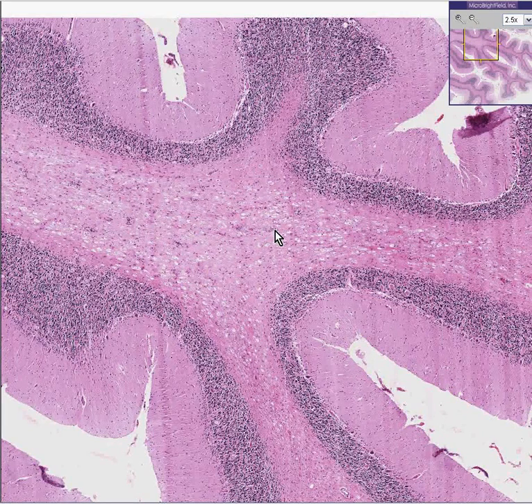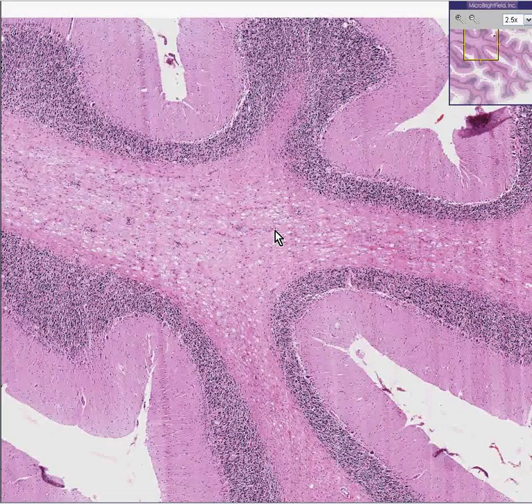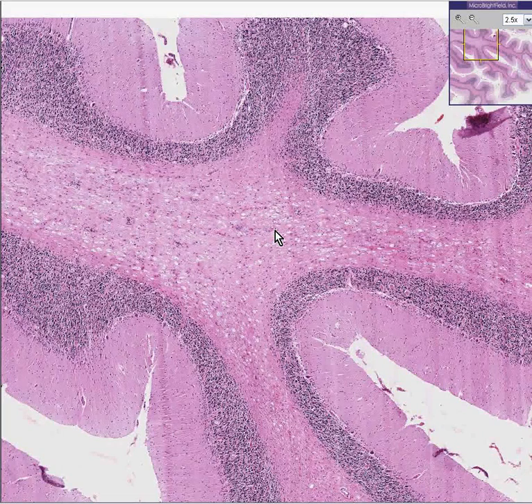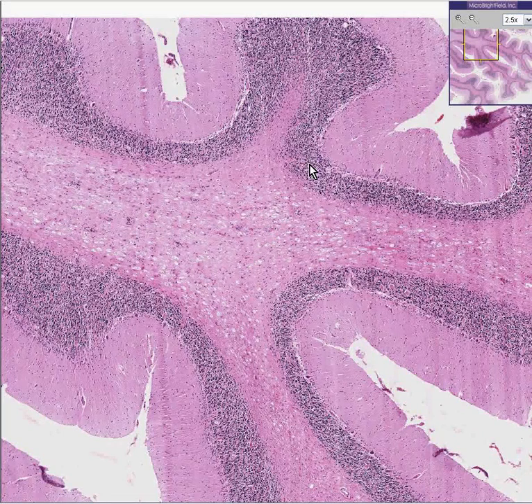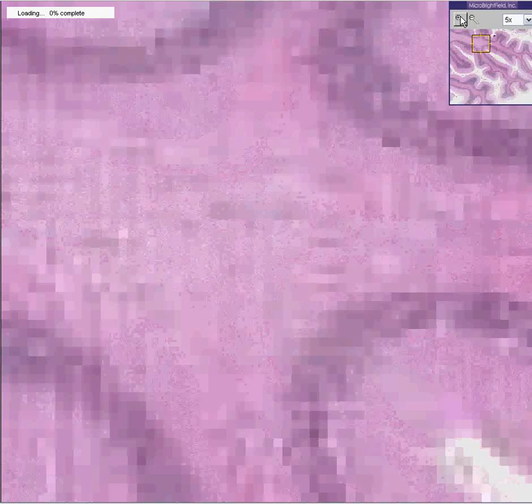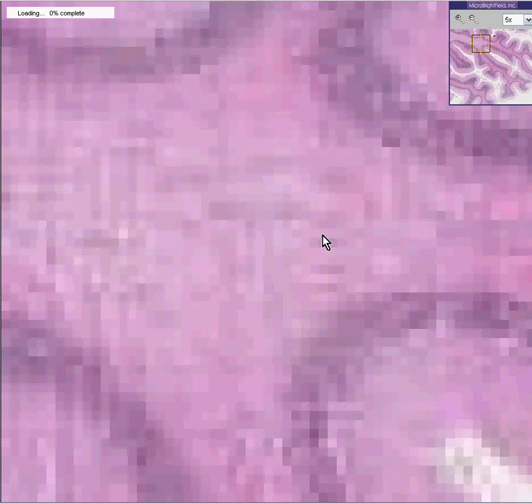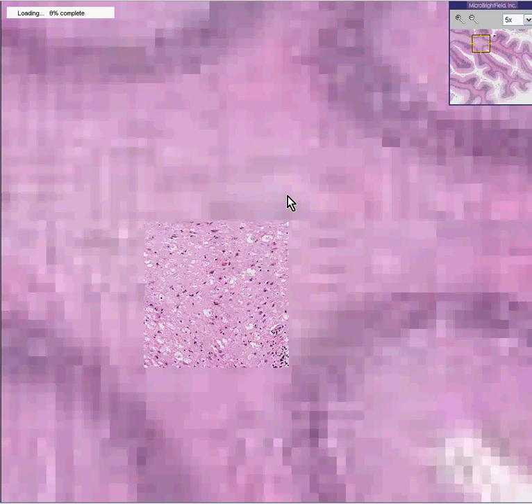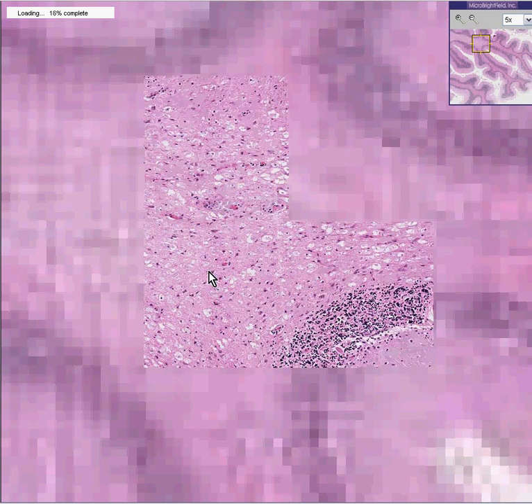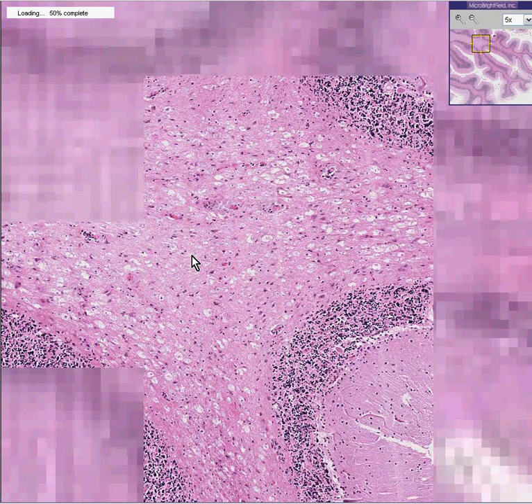Whenever you are looking at myelin anywhere in the central nervous system, and it is in areas lighter than it should be, you can suspect that there was abnormal myelinization. In this case, they're all hereditary.